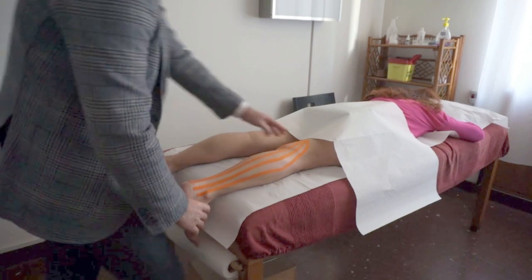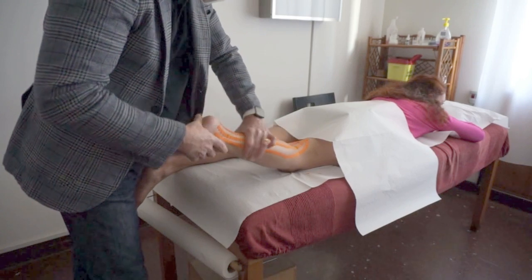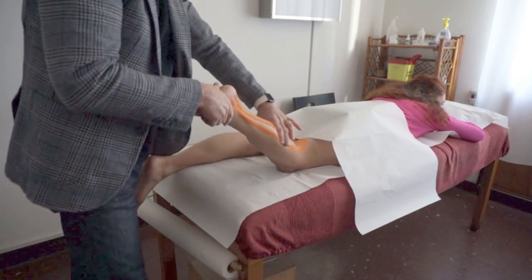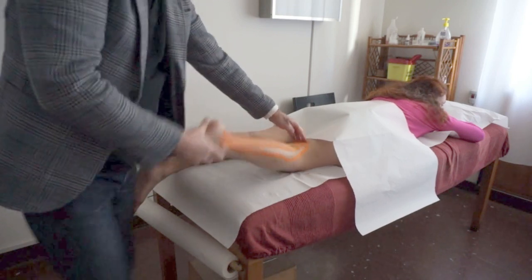The more area you cover, the more compression the tape is going to create. Between 30 and 50% is our ideal surface area being covered.